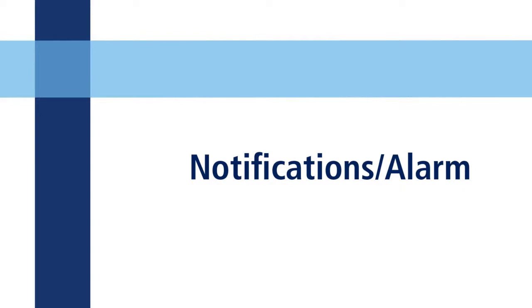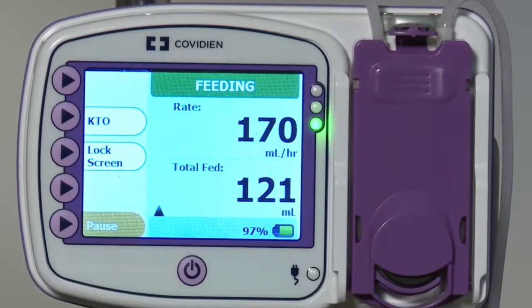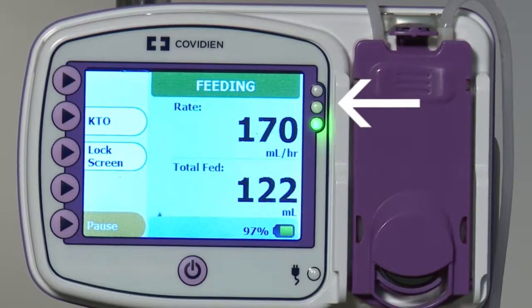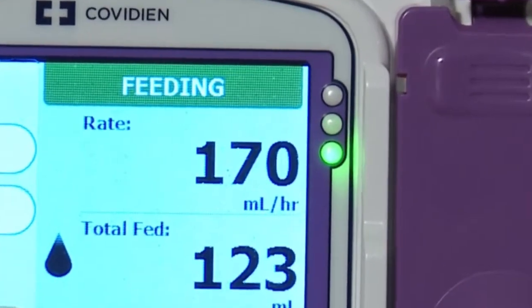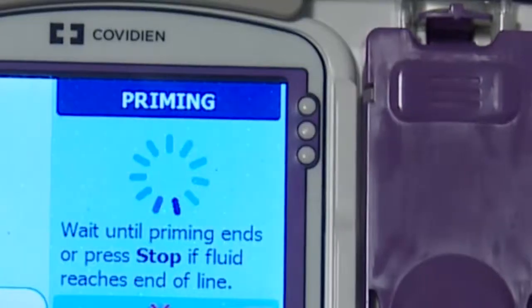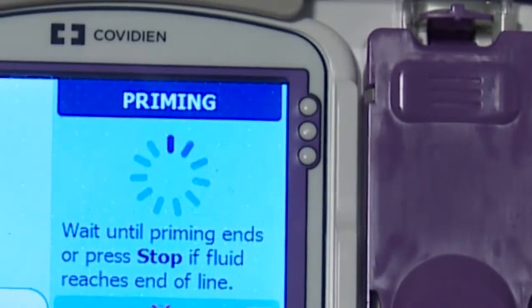Notifications, alarms. The pump status LED indicator lights on the upper right of the pump face give a quick visual indication of the pump status, especially in darkened rooms. A solid green light indicates the pump is feeding. A blinking green light indicates the pump is ready for operation, but not feeding.